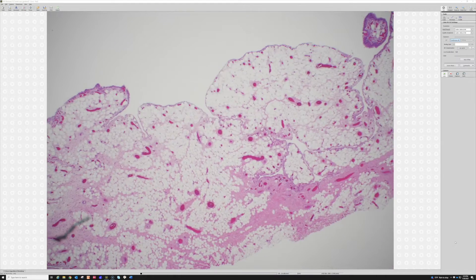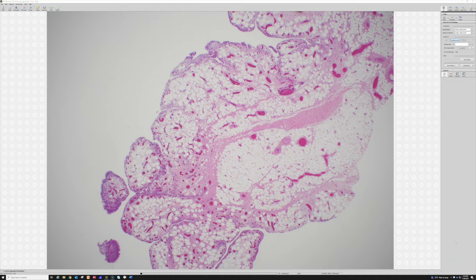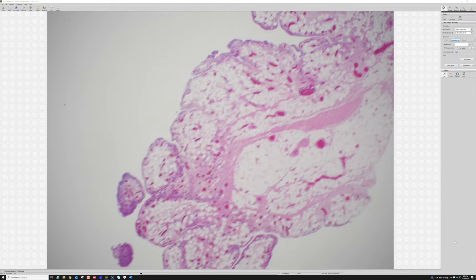It looks like mature adipose tissue, and there is adipose tissue around the joint as well as fibrous tissue, but this is being pushed into the joint with these multiple polypoid shapes.